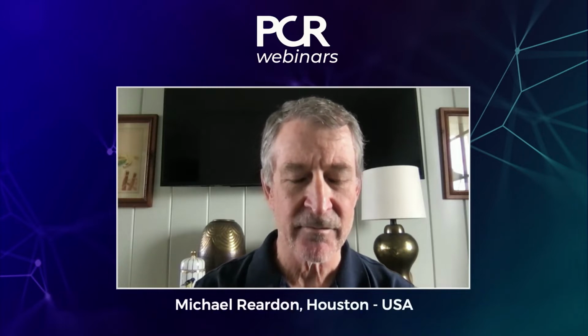Well, I think, Lars, it's very clear that those that have poor ejection fractions do not handle aortic insufficiency well, no matter how it hits them. And so the lower the gradient, the worse the ventricular function, the more important it is to just trace paravalvular leak. So I would agree with you that paravalvular leak is important. It's important in all patients, but it becomes more important as your ventricular function goes down, because your heart's ability to compensate will decrease.